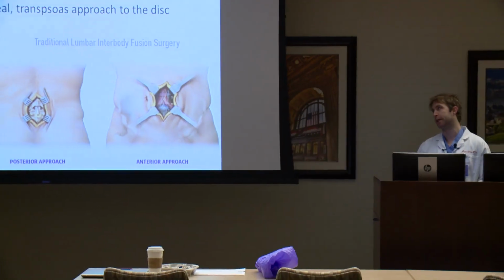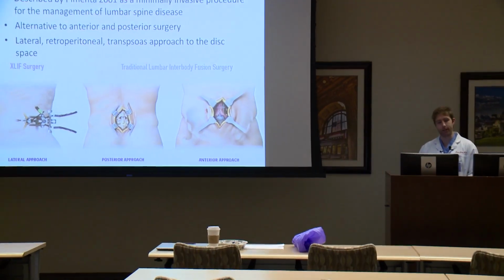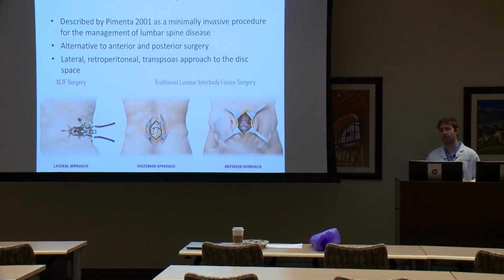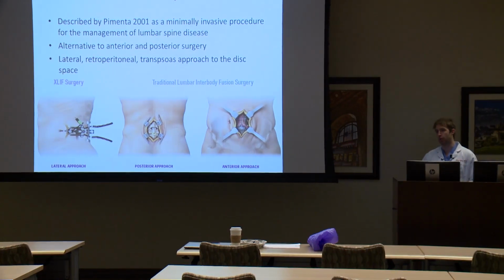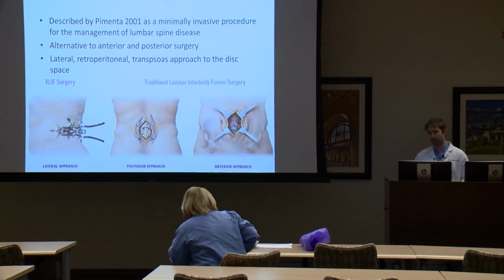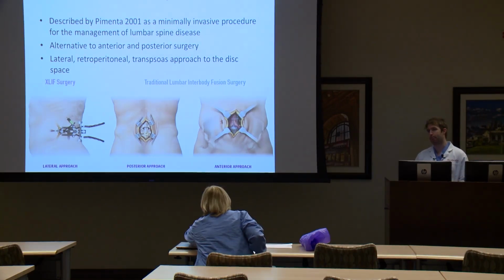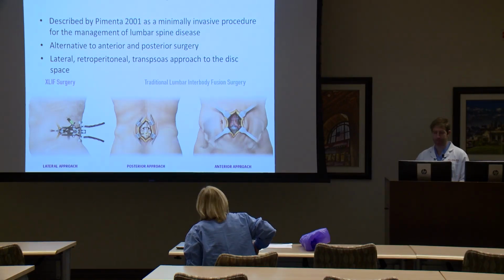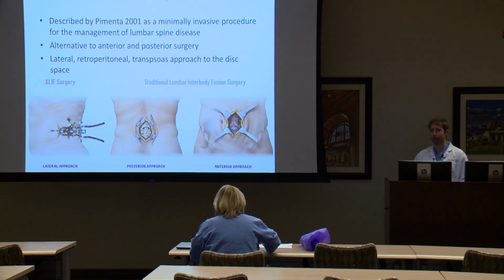And so a little bit about the history. About 2001, the smart guy said he was tired of going from the front where there's a bunch of big blood vessels and dangerous things, and we typically need vascular surgery to bail us out as far as getting us the approach. And he also said he's tired of going from the back because, and we'll get into it a little bit later, it's really difficult to get a large cage, what we put in the disc space to help us with fusion, from the back, because there's those little things called the nerves that are right in your way, and so you have to avoid damaging them.